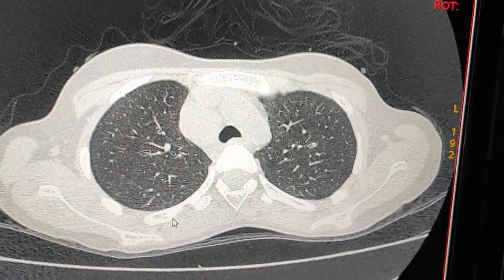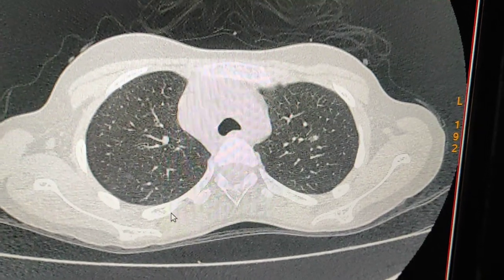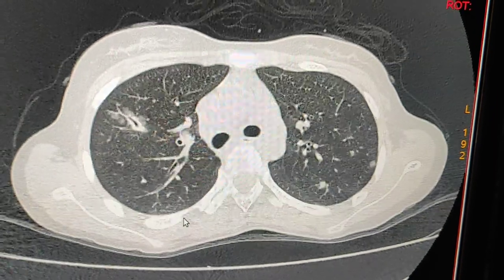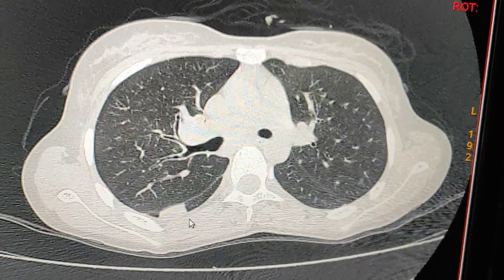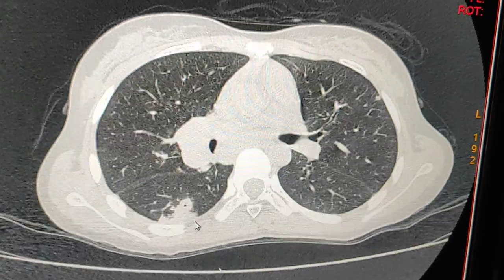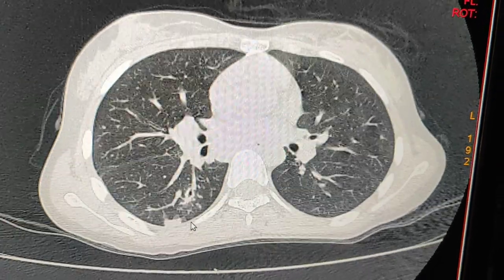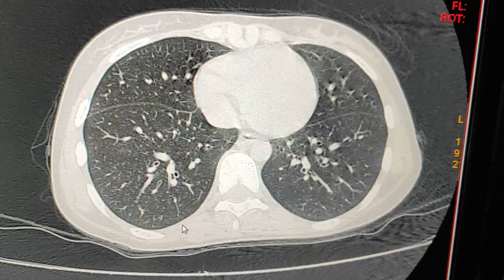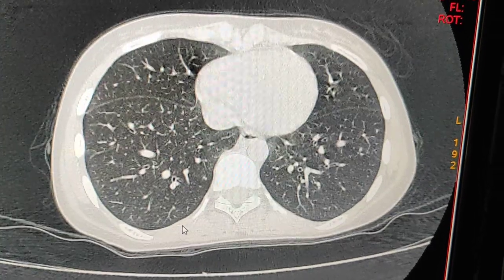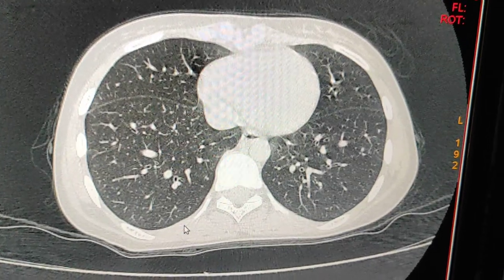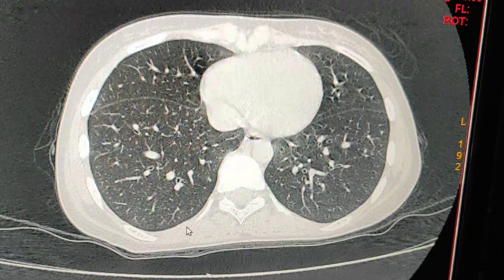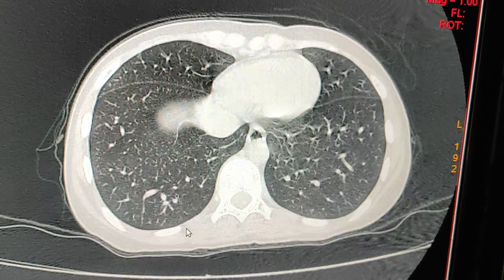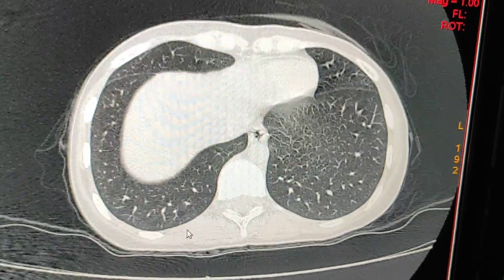This picture of the CT scan lungs may represent Koch's disease. Further lab data correlation would be worthwhile to confirm the diagnosis.